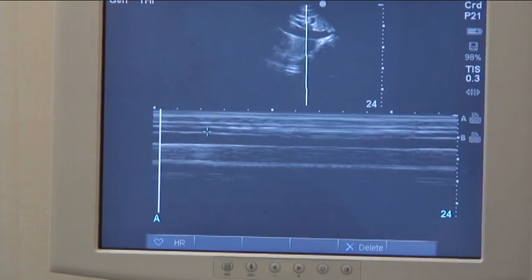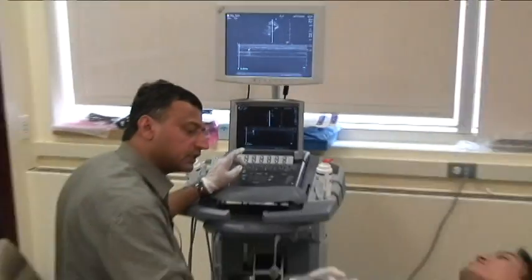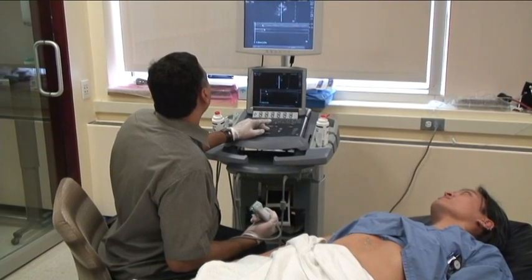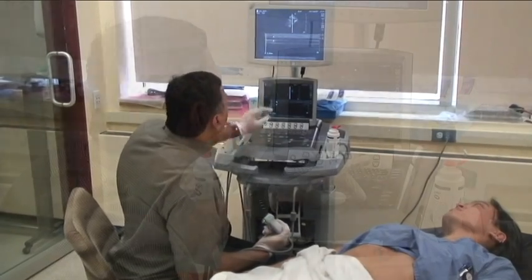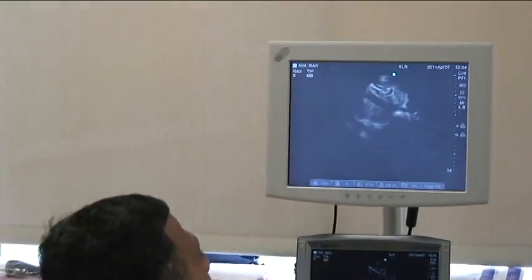and you hit select here. I'm sorry about that, James. And remember, when you're doing these things, particularly when you're doing the subcostal and getting the IVC, you pretty much are putting a lot of pressure there, so it can be a little uncomfortable to the patient. Okay, so now we are at the point that we were looking at the IVC.